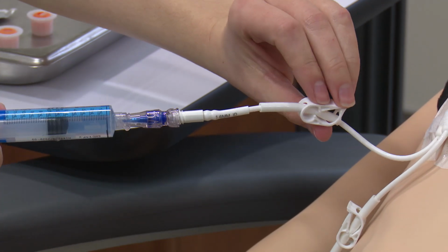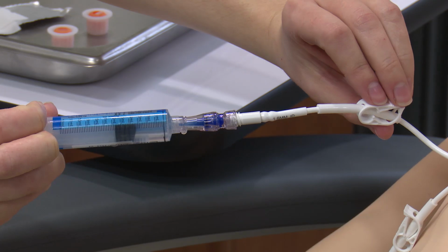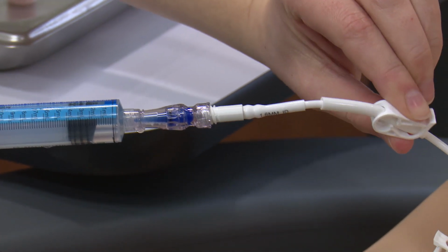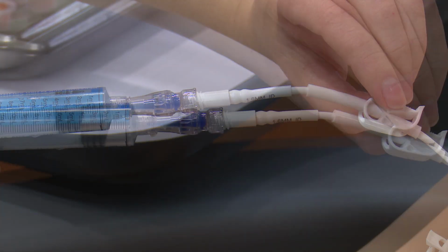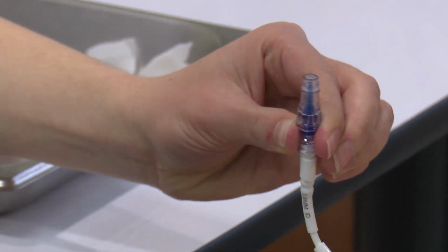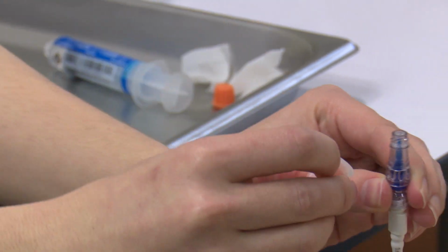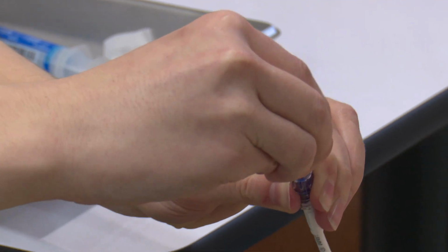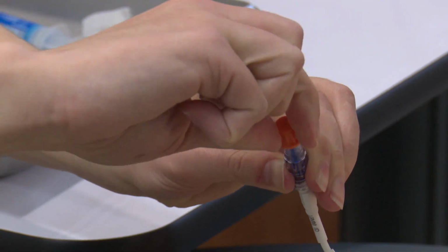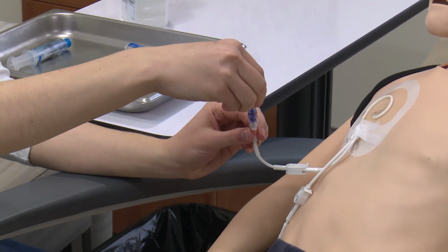Unclamp the lumen and press the plunger forward slowly until the right amount of heparin has been put into the lumen. Clamp the lumen. Remove the used heparin syringe from the cap by twisting it counterclockwise to the left. Attach a swab cap or pumpkin by pushing it on and twisting. If your child's central line has 2 lumens, repeat these steps with the other lumen.